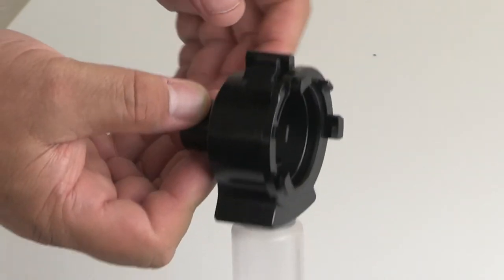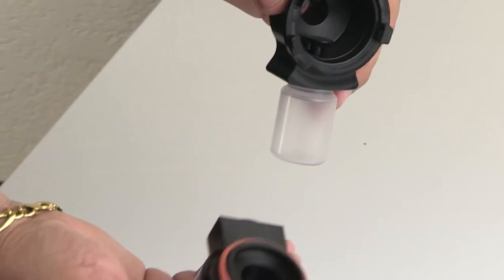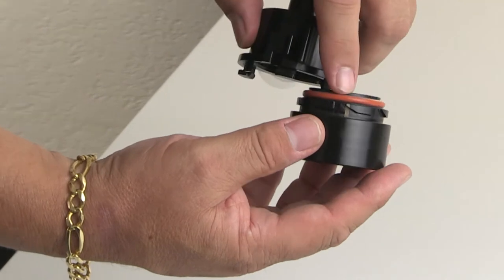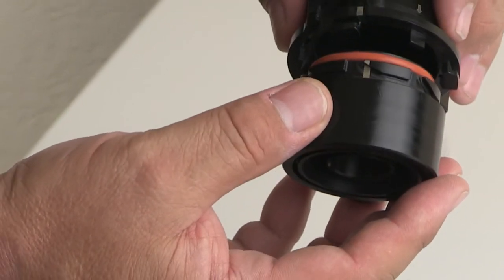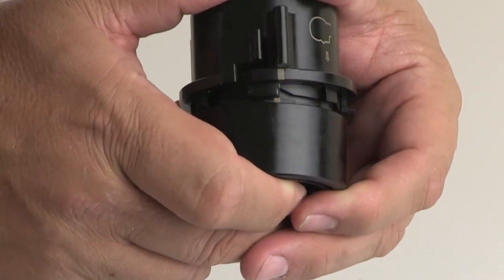The second step is I'll take the patient side of the valve, the other side, and again you'll see the two lines. There's one line, there's the other line. I will position them together and just give the valve a good press.